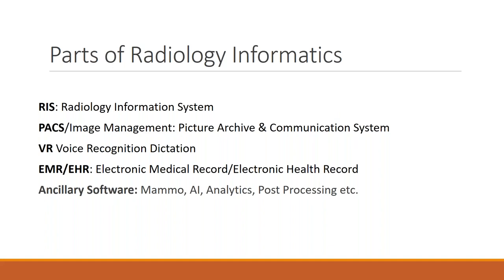VR, voice recognition. EMR or EHR, your electronic medical record, electronic health record. And then you have ancillary software. You have mammography programs that measure your MQSA and collect your data. You have your AI. You have analytics and post-processing, et cetera. So there's a lot of software out there that we're going to talk about, or at least briefly touch on. We won't get too deep into these, but these are the parts that we're going to go over today.